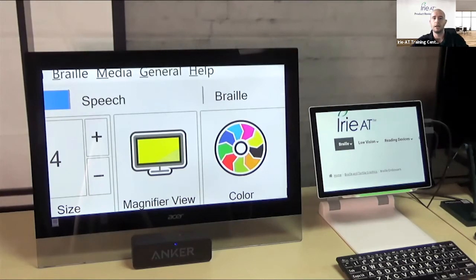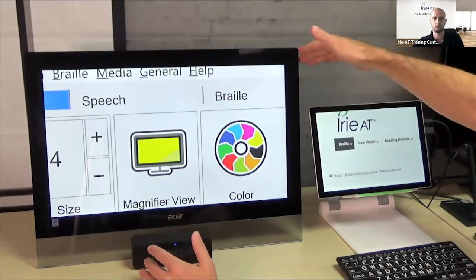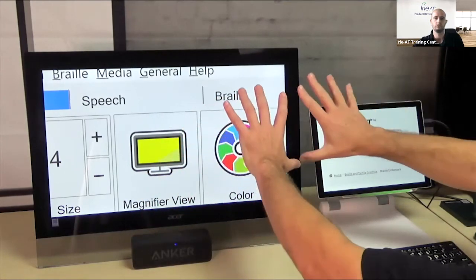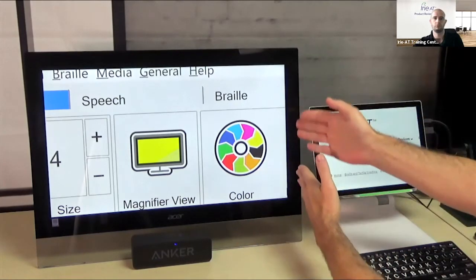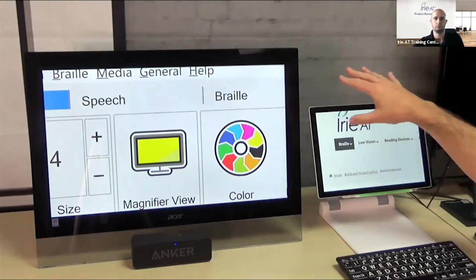Any more questions? Yes, we had Linda asking about the term span, which I believe she's referring to the external monitors. What that is basically, Linda, is you can span your desktop or expand it to multiple monitors. So it'll kind of be like extending it, if you will. It would be weird with two monitors that aren't the same size, but imagine if I had ones that didn't have boundaries right next to each other, then it would essentially just make the screen fit around all of that. There'd be a brief interruption between it, but it would just be making a 24-inch monitor into a 50-inch monitor.